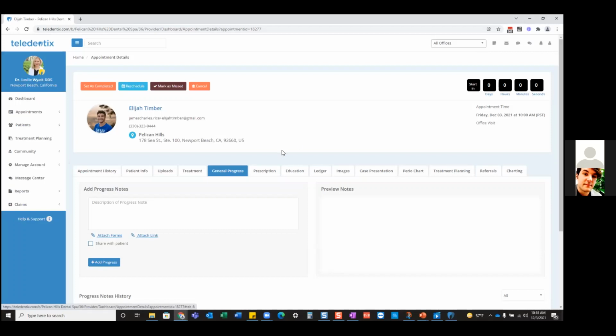So yeah, let's see here. All right, so in terms of sharing those images, I think we did.